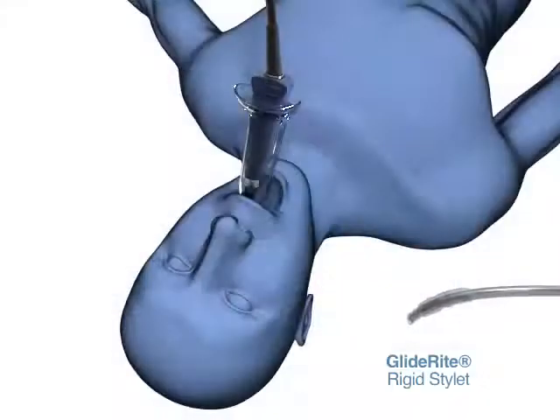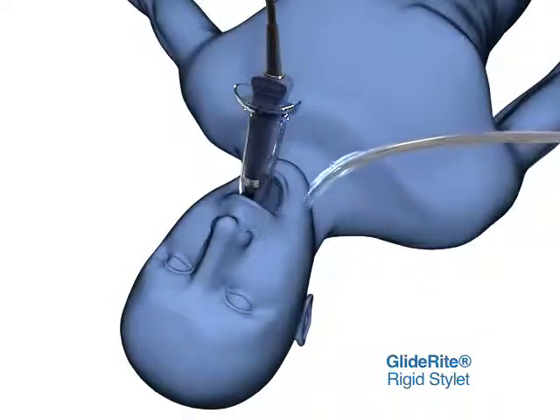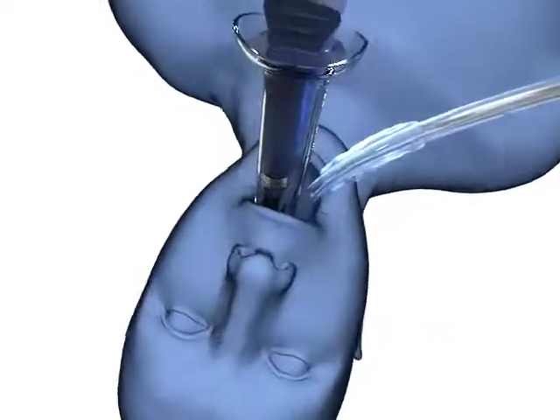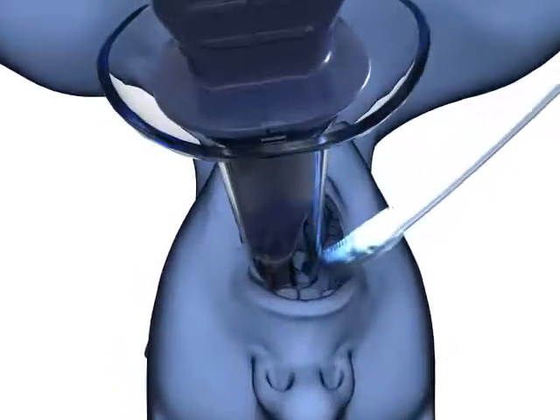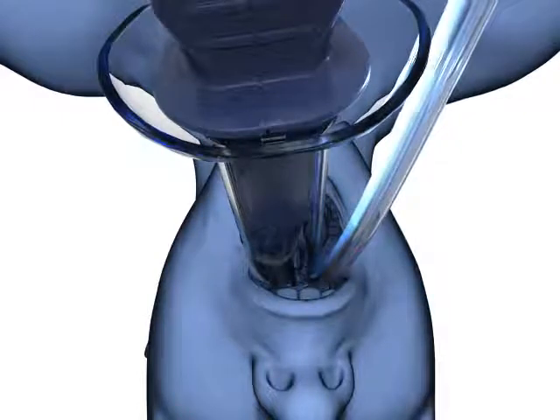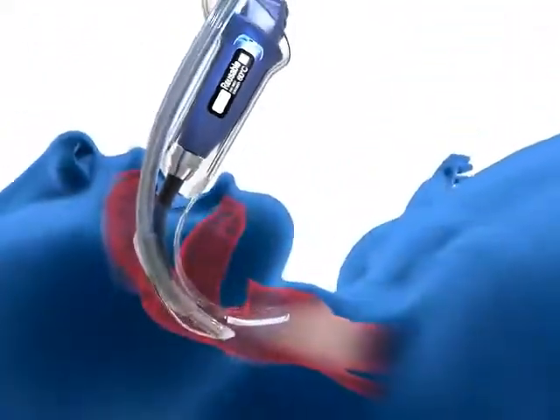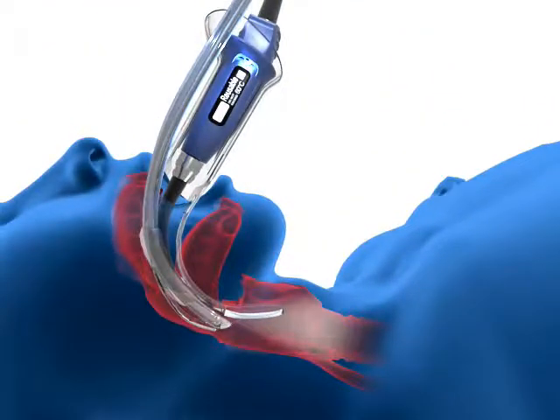The endotracheal tube, which in this case is shaped by a Glide-Rite rigid stylet to complement the angle of the GlideScope video laryngoscope, is inserted under direct vision until the distal tip of the tube is very near the distal tip of the laryngoscope. This relationship is quickly and easily achieved, and only then should you return to looking at the video monitor.